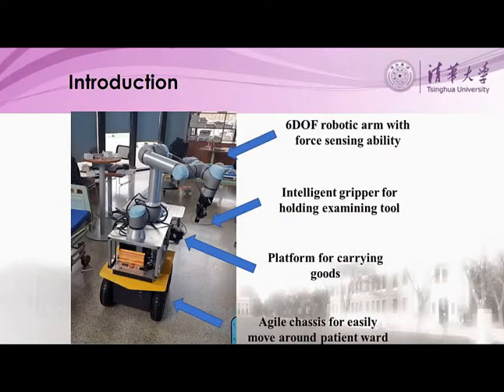This robot has a six degrees of freedom arm for sensors, a gripper, a chassis, and a platform for carrying medical devices and goods.